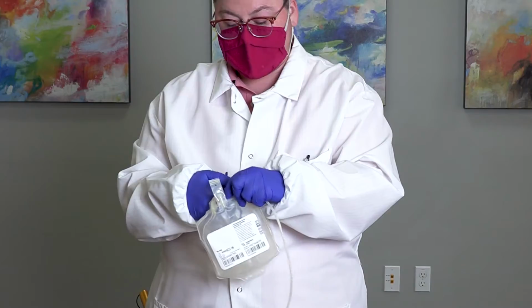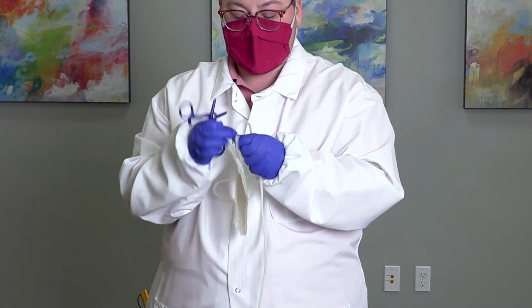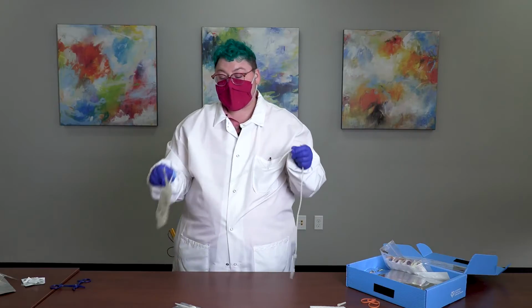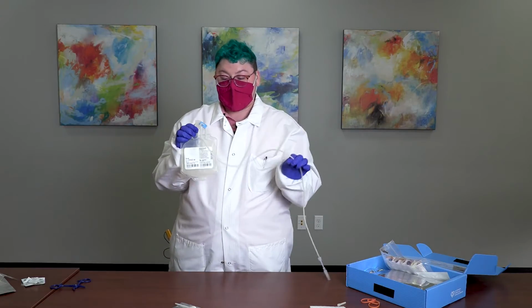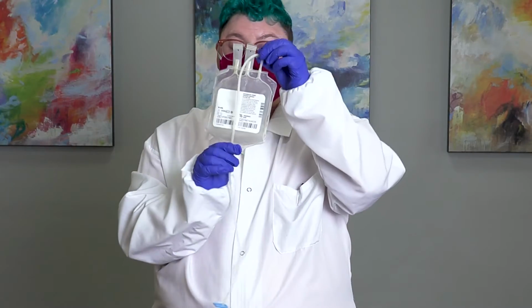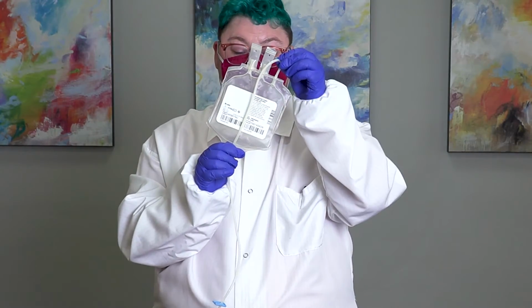Slide the second blue clamp along the tubing line to seal it. At this point, we'll want a permanent seal. So you'll need to tie 2 tight knots along the tubing line. The first knot needs to be about 6 inches from the edge of the bag. Conveniently, this collection bag is approximately 6 inches long, so you'll want your first knot to be tied right here.